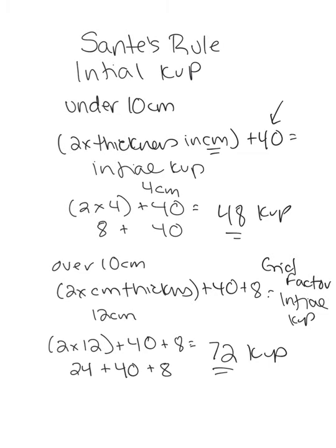Now we're going to be working with Sante's rule in lab, where we're going to be doing measurements with calipers, but this is how you're always going to figure out that initial kVP. All you need is a caliper to do your measurement with.